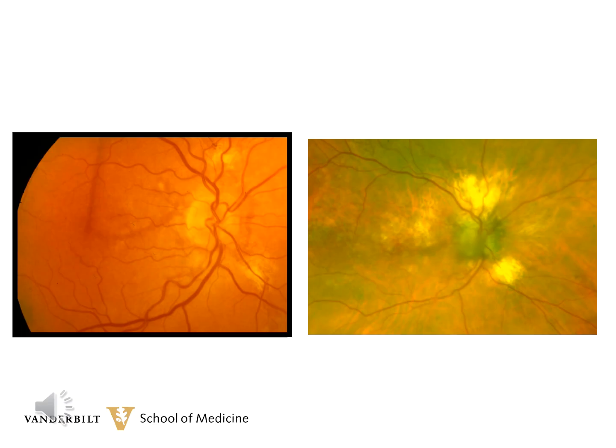At one time, we tried to extend out to 6 or 8 weeks, but she rebled, and she's on a every month basis, and she's been that way for at least 6 to 7 years. You can see some more atrophy in the macula, and the streaks superiorly and infranasally from the nerve are wider and much more atrophic than when she first presented.